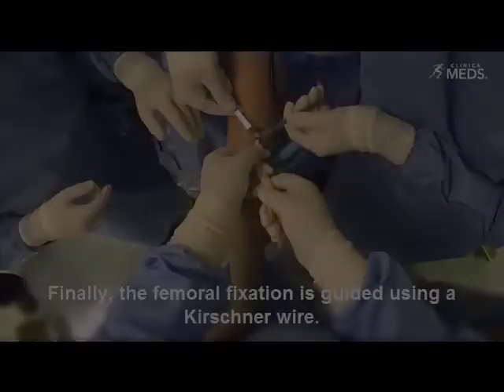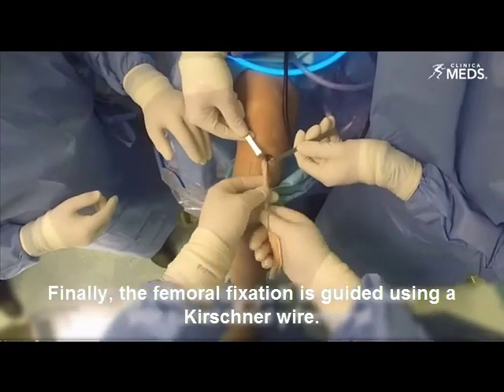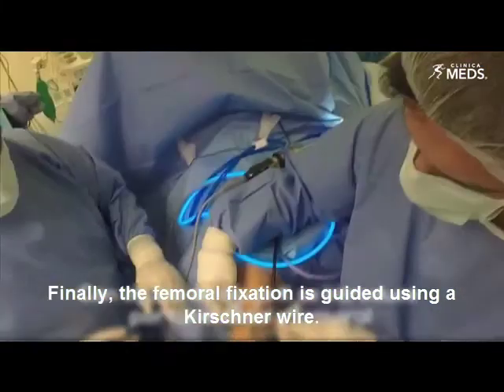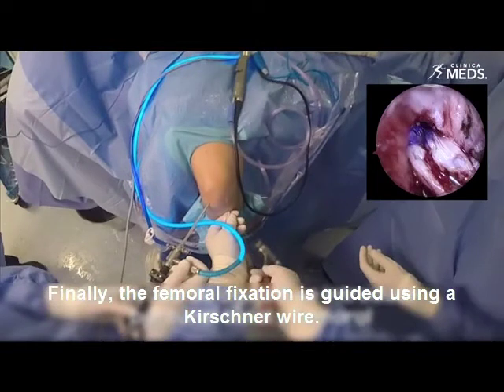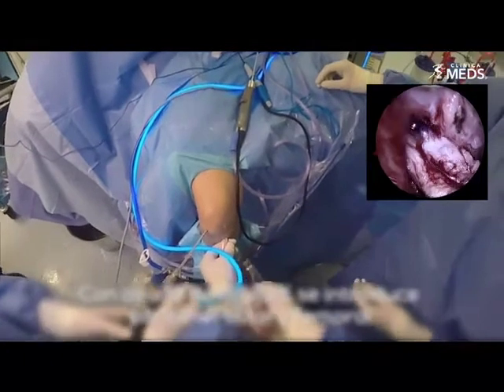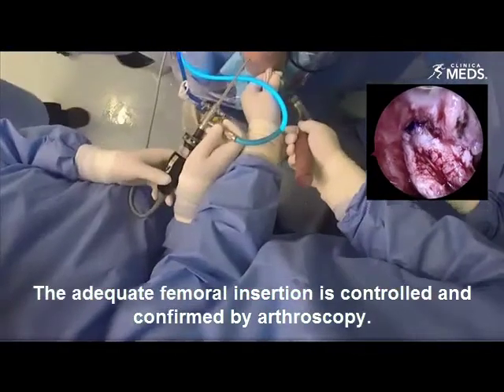Finally, the femoral fixation is guided using a Kirschner wire. The adequate femoral insertion is controlled and confirmed by arthroscopy.